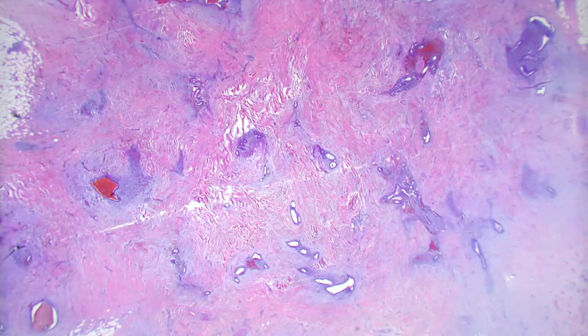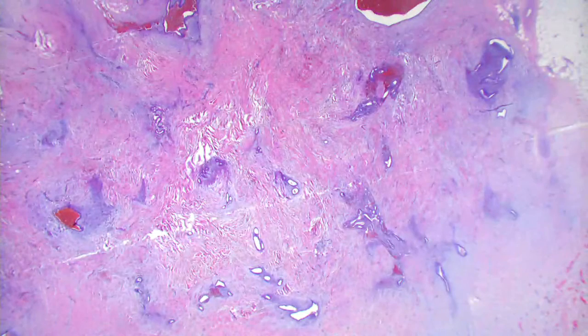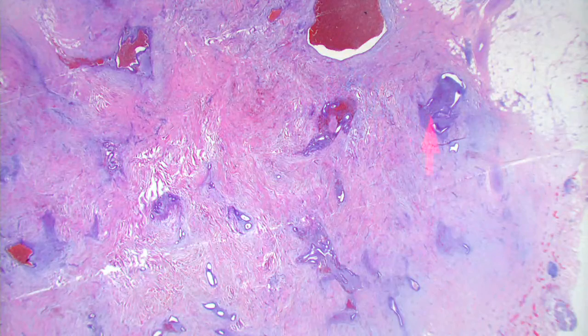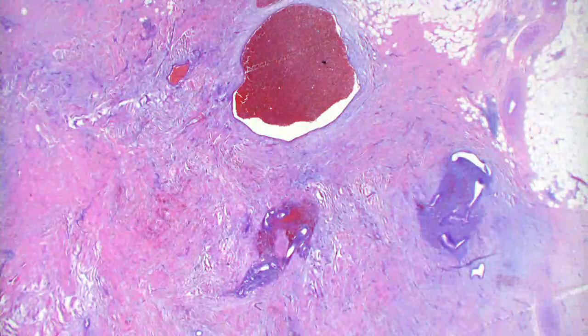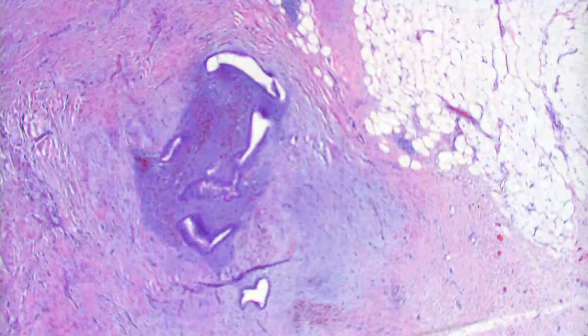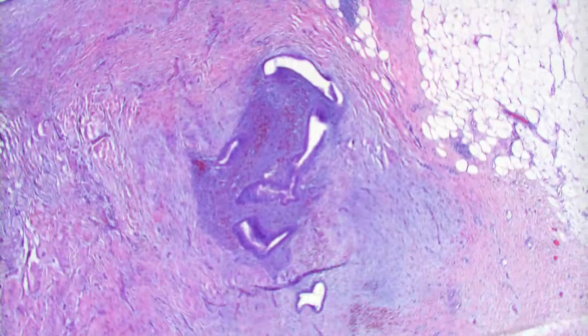Okay, so in this one, it looks like a shelled out, not shelled out lesion, but I don't see any epidermis here. Yeah, good. If it's a skin lesion, it's certainly deep to the epidermis, right? Okay, so you got a lot of dermis, and then you've got some structures in the dermis. They look like these glandular structures or ducts. Yeah, good. Some of them are blood filled. There's a lot of extravasated erythrocytes as well, and this loose fibromyxoid stroma. So I was thinking either cutaneous endometriosis, but some of it looked maybe a little funny, and so I was thinking a cutaneous metastasis of endometrial carcinoma.